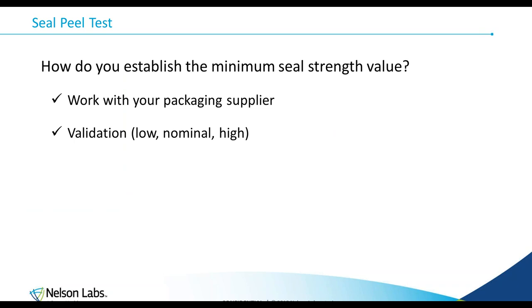As far as establishing minimum seal strength, that's up to you. You can work with your packaging supplier to do it. You can do a validation. You can do a low, nominal, and high. Don't choose a minimum seal strength value that is too high. Use something realistic. The industry often uses 1 pound per inch, but that's not based on any data. It's traced back to the paper industry.